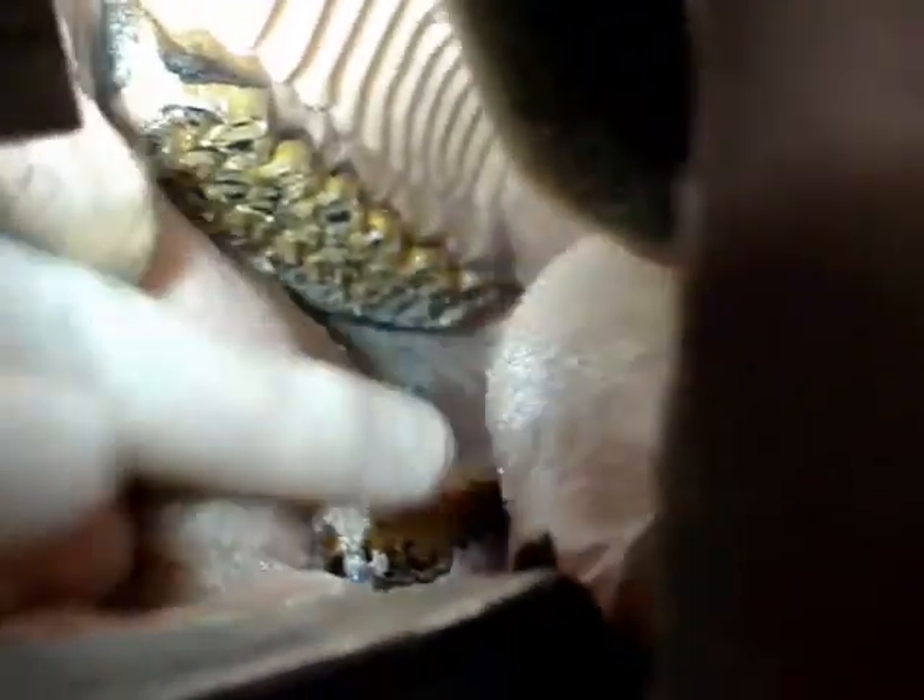Bit seats are created on the front corners of the first cheek teeth. It is thought that by removing this sharp corner, pain may be avoided when the bit pulls the soft tissue of the lips up against the corner.